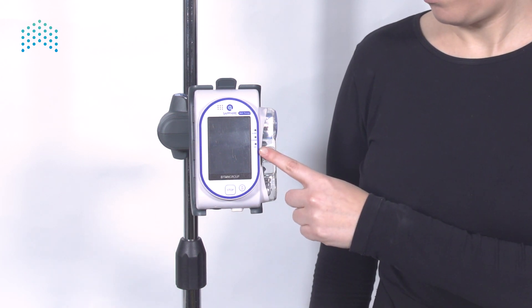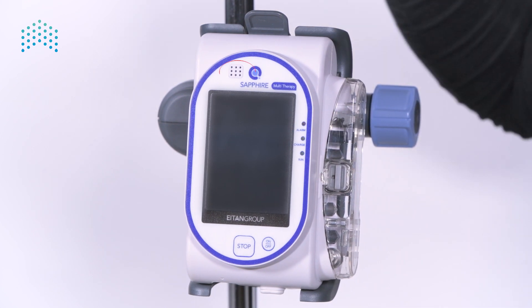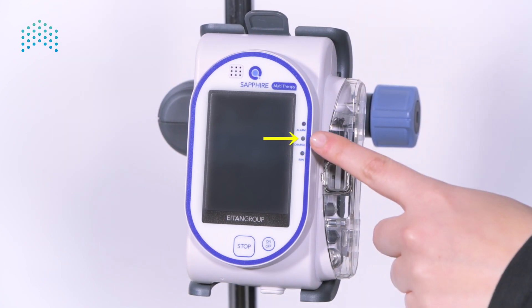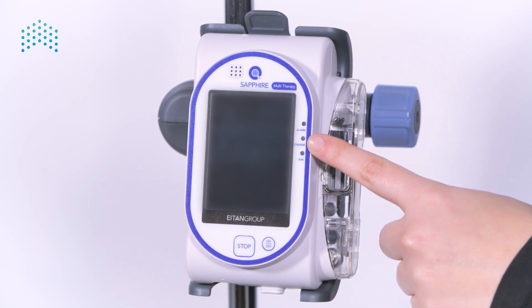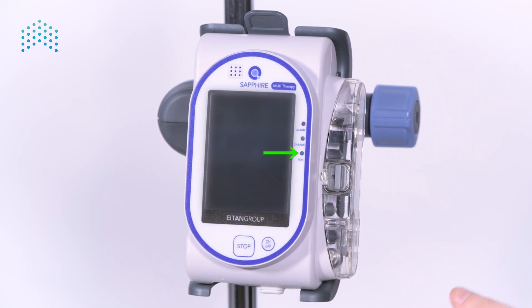On the right side of the screen there are three indication lights. A red alarm light — if an alarm is active, this light blinks red and is accompanied by an auditory signal from the speaker above the screen. A yellow charge light — if the pump is connected to a power source, this light is active either blinking to indicate that the battery is charging, or steady to indicate that the battery is fully charged. A green run light — if an infusion is running, this light blinks green.